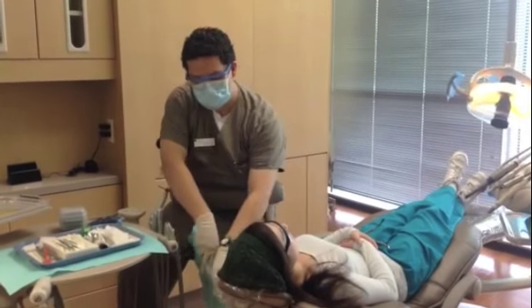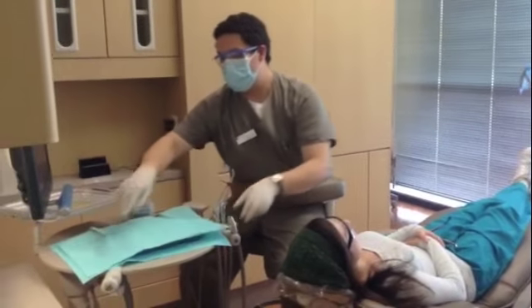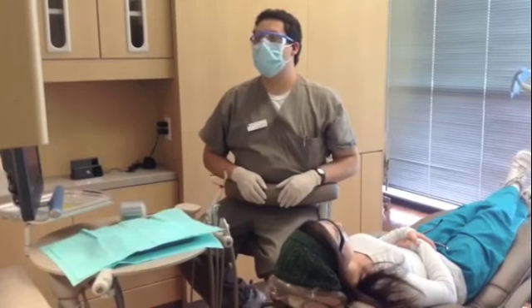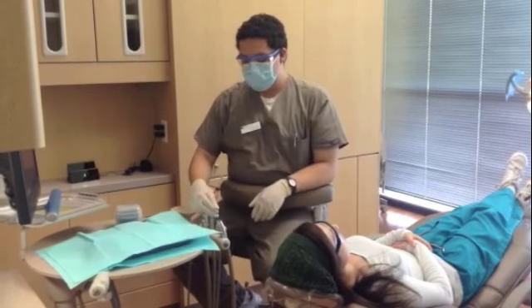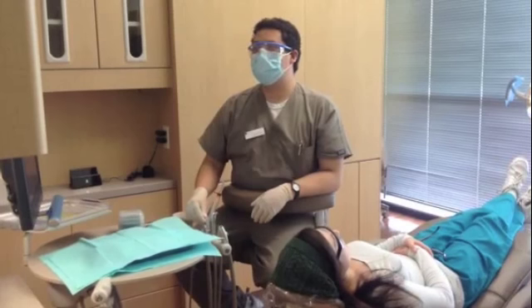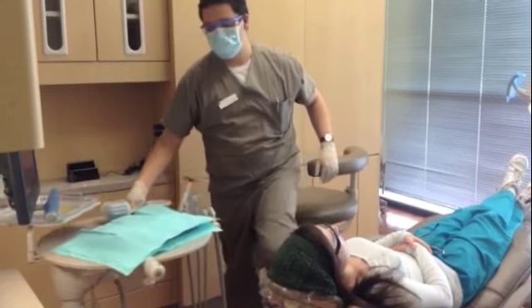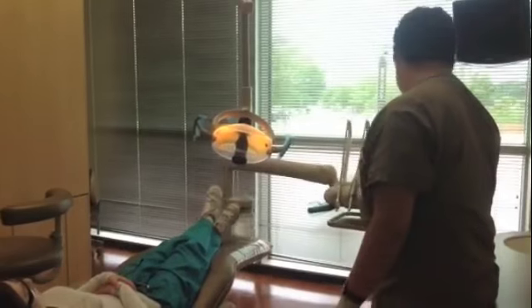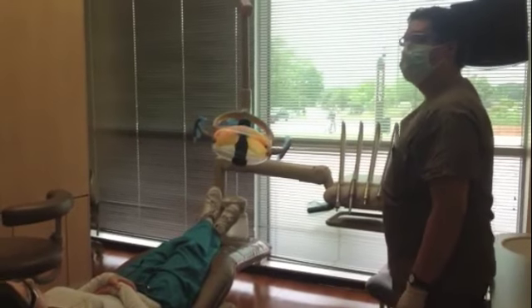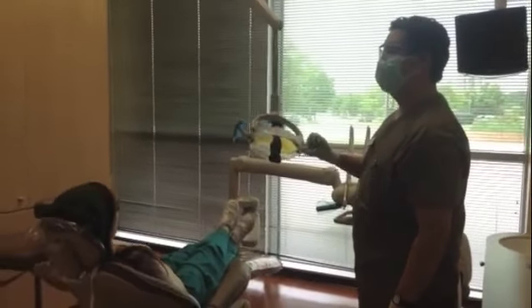and place it on top of the tray that you just used. The next thing is to remove the saliva ejector tip, the air water syringe tip, and the HVE tip. And you'd also want to make sure that the operator stool and the rheostat and the control panel here are moved out of the way. Then you'd want to move the patient up, let them get out of the seat.